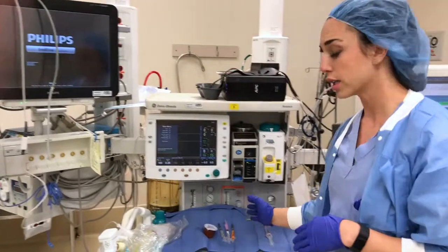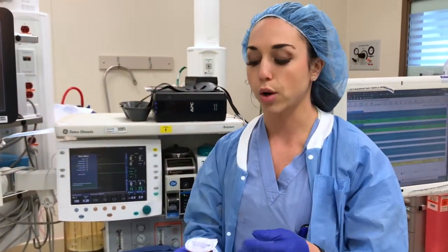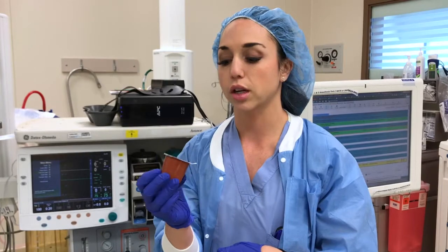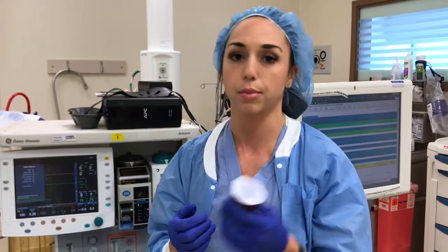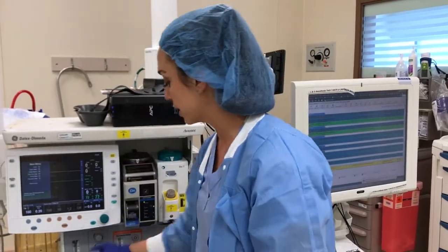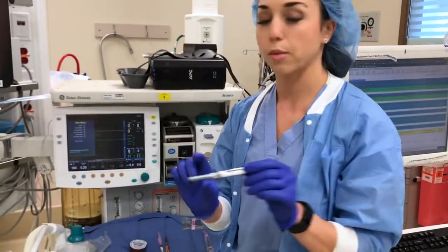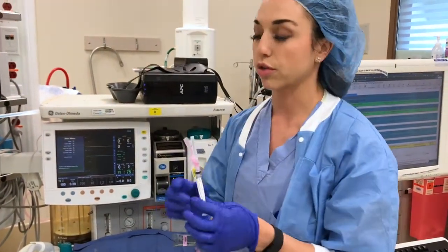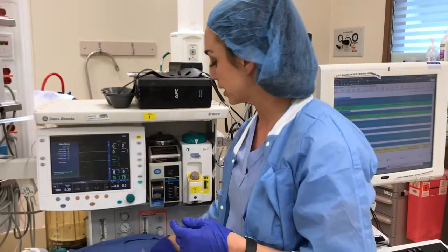And then for your drugs, again, for most of our tubals, these will be postpartum patients, so they're still at risk for reflux, so they're going to need Bicitra. Some patients, if it's a D&C that's only 4 weeks, for example, that's not at risk for reflux, you may not need it, but usually it's a safe bet to have your Bicitra out. Some Zofran you may or may not need. They may or may not get it preoperatively. And then a syringe for your Reglan, which you will put in your IV fluid just like the C-sections.